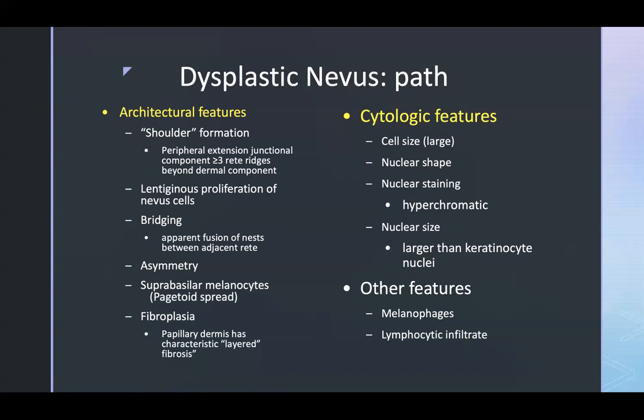So it is possible to have a dysplastic compound nevus with mild architectural disorder, but severe cytologic disorder, or you could have a dysplastic compound nevus with severe architectural disorder, but only mild cytologic atypia. So it's possible to have different combinations. It becomes very confusing when you're trying to grade 2 separate parameters in a lesion, because that just increases the variability from one pathologist to the next.